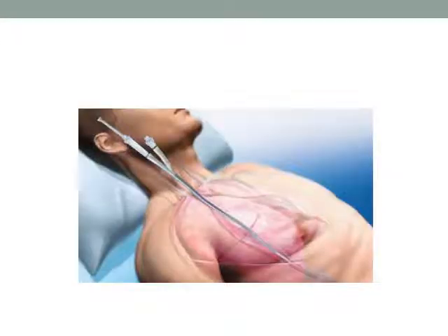So this is a cutaway cartoon of a properly positioned Avalon. And how many of you have not seen an Avalon? Okay. It's a huge cannula. The biggest one is 31 French, so we're talking about over a centimeter in diameter. It's 11 millimeters. It's over a centimeter in size.